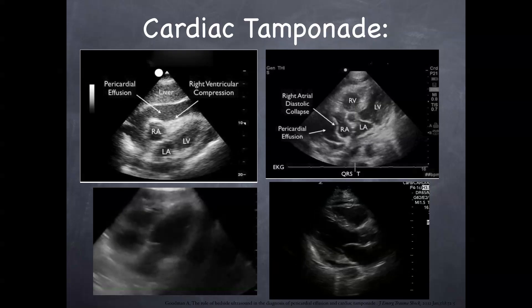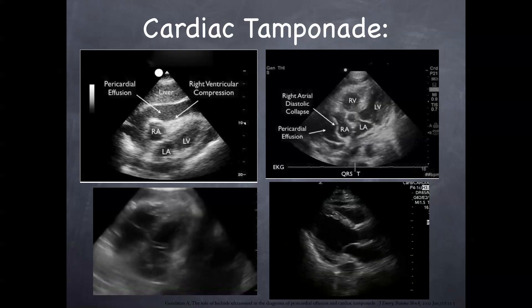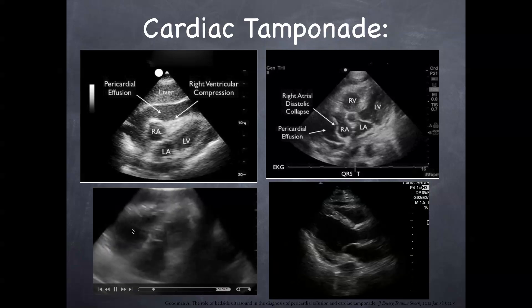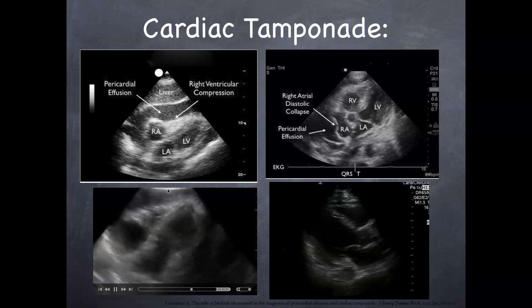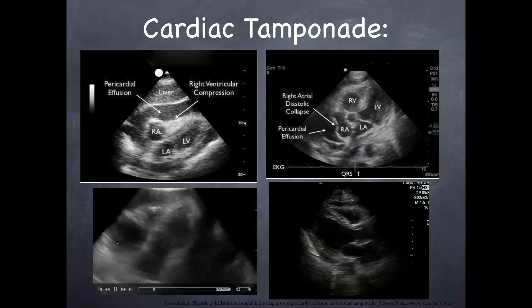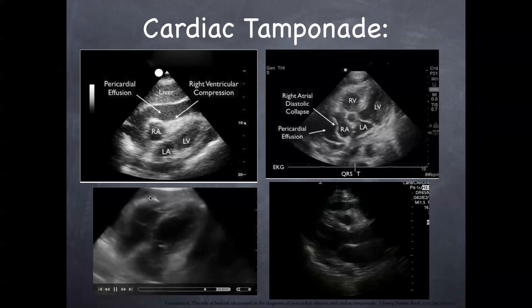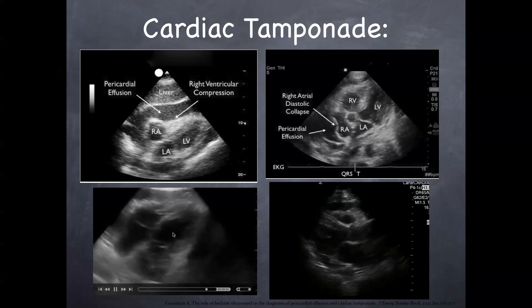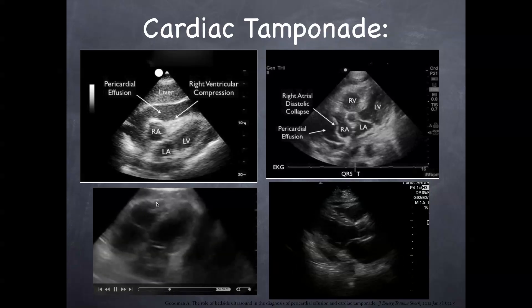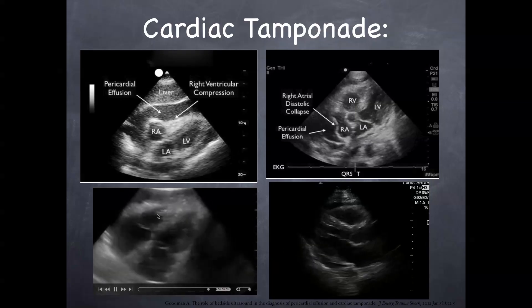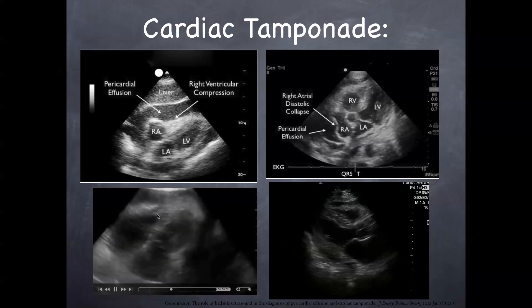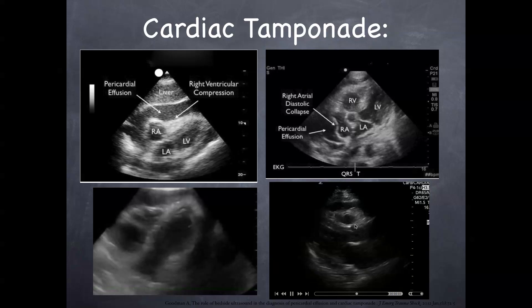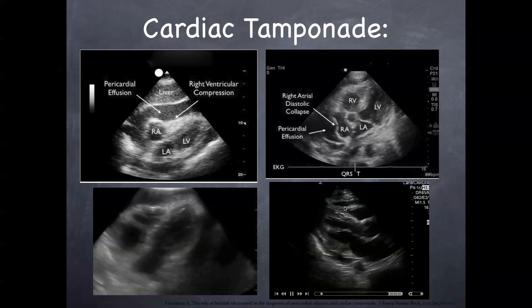When we assess for tamponade on ultrasound, you can look at the right atrium, which tends to be the first thing to show scalloping. The pressure from the outside of the heart from the fluid causes clinical tamponade, pushing inward on that right atrial wall. More commonly described in textbooks, the right ventricle during diastole shows scalloping motion inward, and the pressure is causing circulatory compromise. You can see this is having a significant effect on the right ventricle in the long axis and apical four-chamber views.